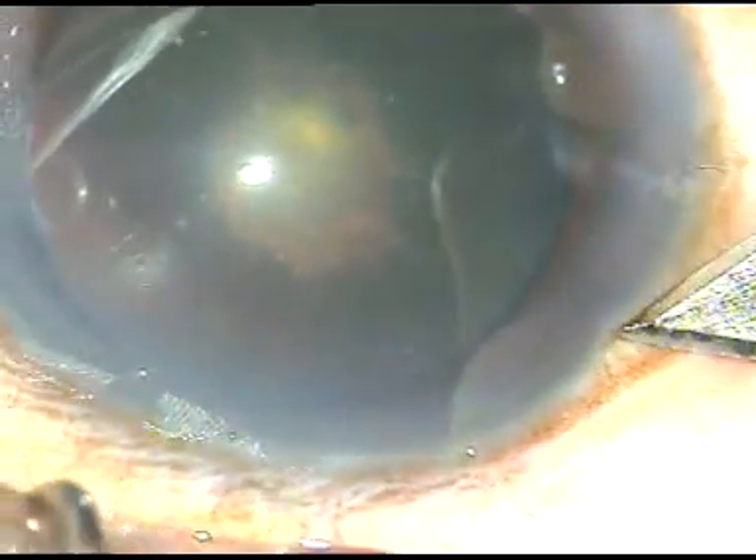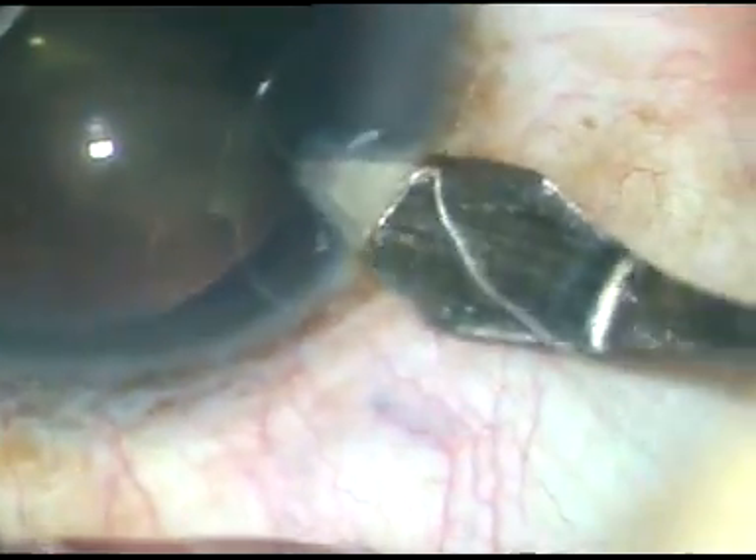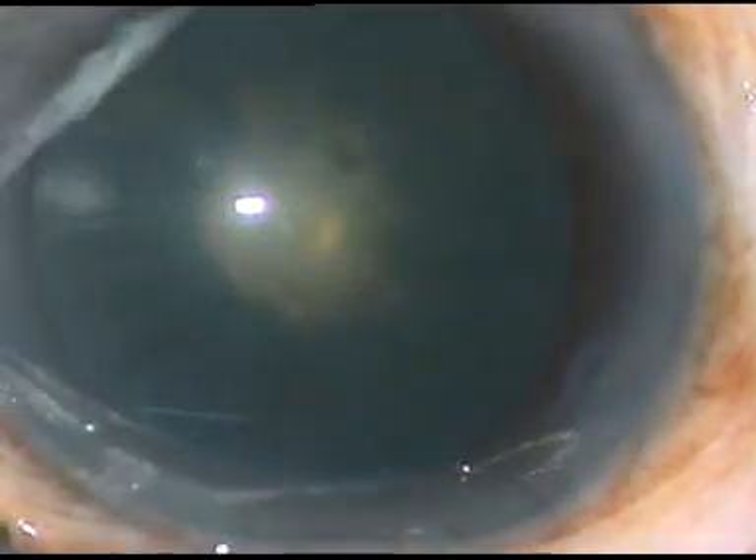Please watch these tips. This is the main incision — a 2.8 millimeter incision at around 10:30 o'clock.